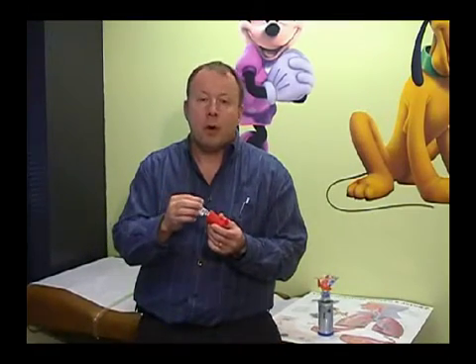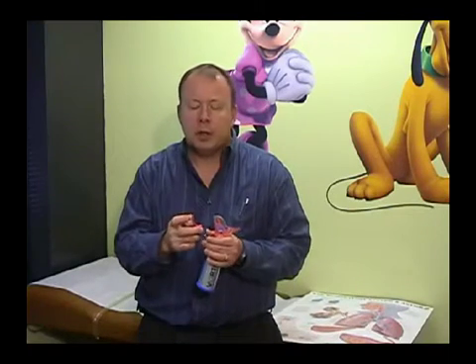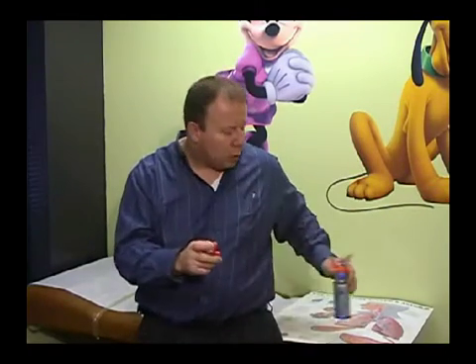is delivered either by the nebulizer or one of the puffer forms. These are often referred to as puffers or inhalers or MDIs, which is short for metered dose inhalers, and this is the spacer. A lot of times you'll see people use the inhalers in TV ads and things, you'll see them shake it up and put it right to their mouth.